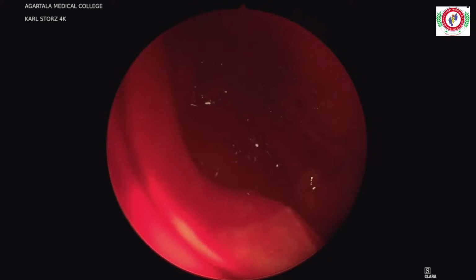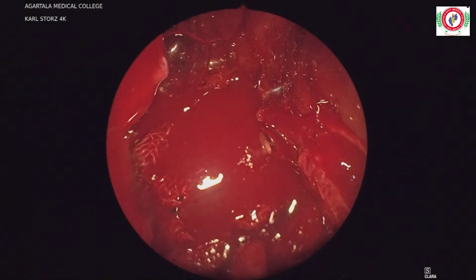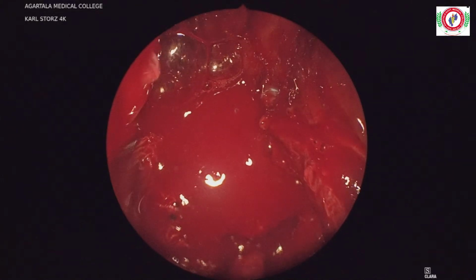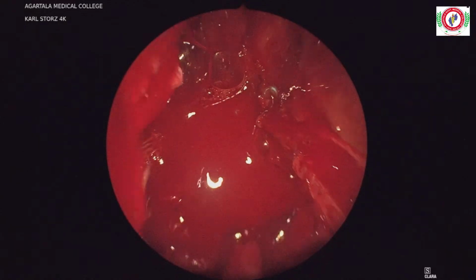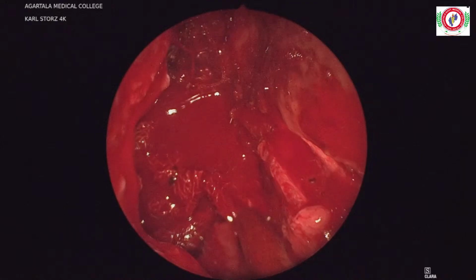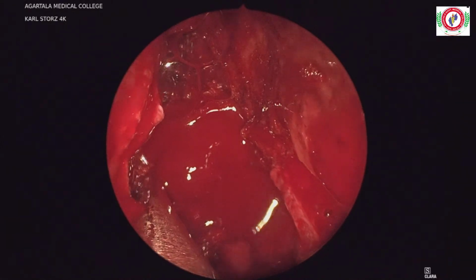Suction. You have a monopolar? Yes, sir. Prepare. Monopolar, put a small suction tip like this over here, and then we'll monopolarize.